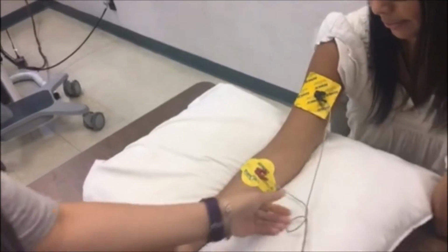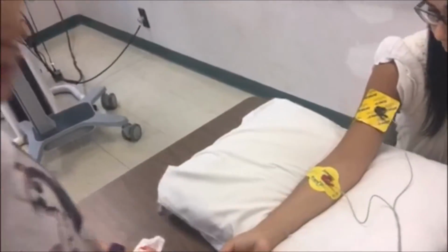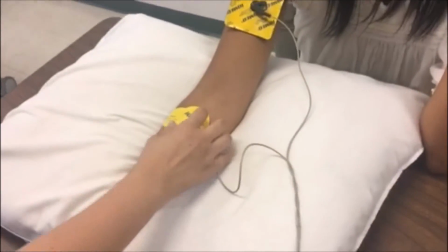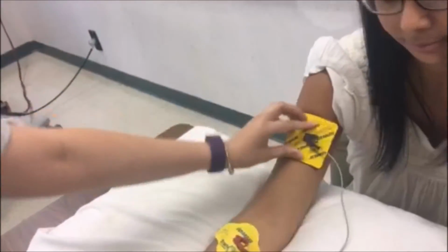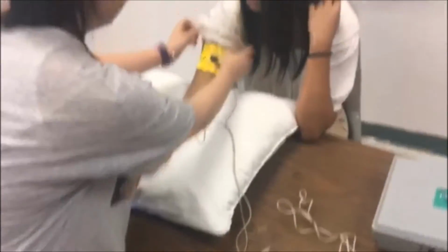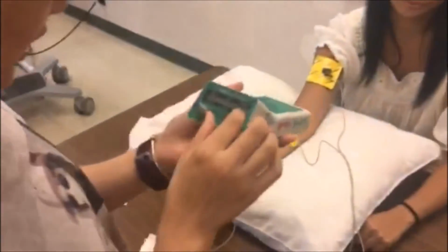Alright, so in this machine, as we all know, the polarities matter. So today we're going to deliver the lidocaine, and lidocaine's charge is positive. So the positive charge goes on the treatment pad, and then the negative charge on the dispersive pad. Alright, so let's turn on the machine.